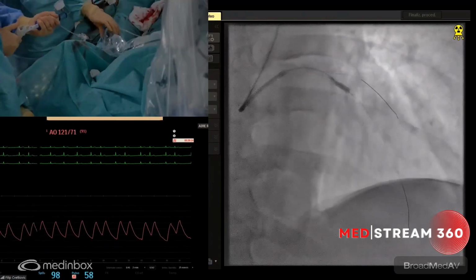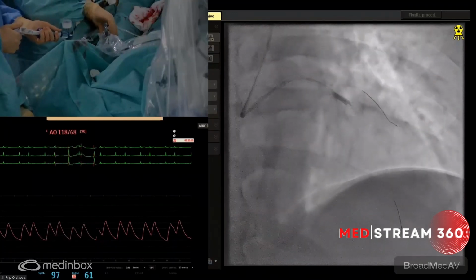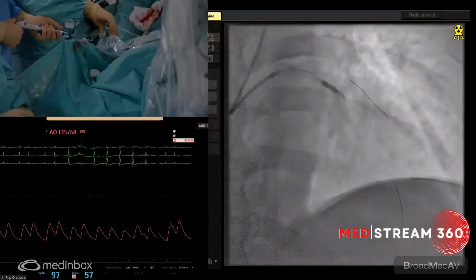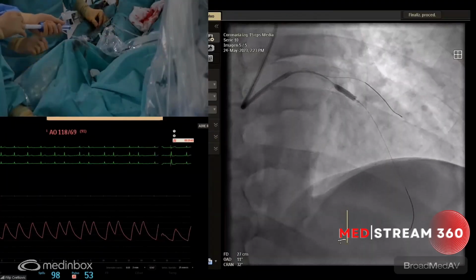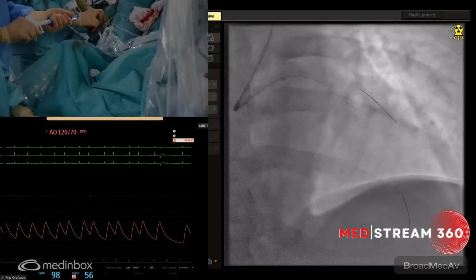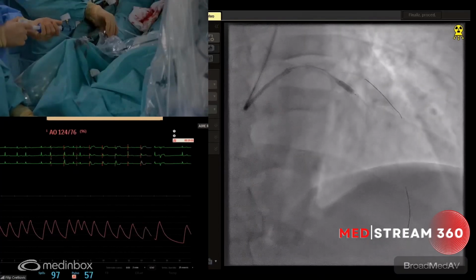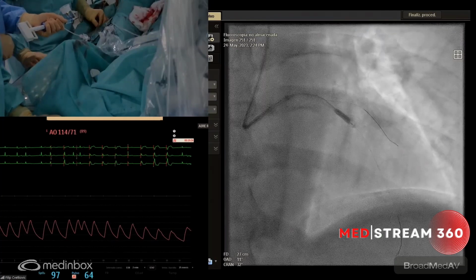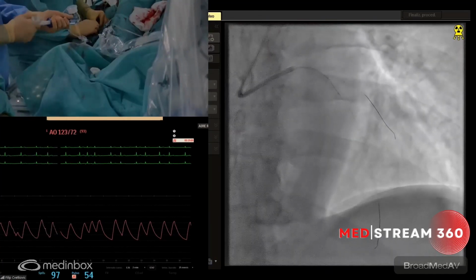4. You can see the captures there and the blood pressure lowering a little bit. Okay, 6. Okay, let's go. The blood pressure is okay. 4. Okay, 6. Probably this is a concentric calcified lesion. Okay, I think I'm there.